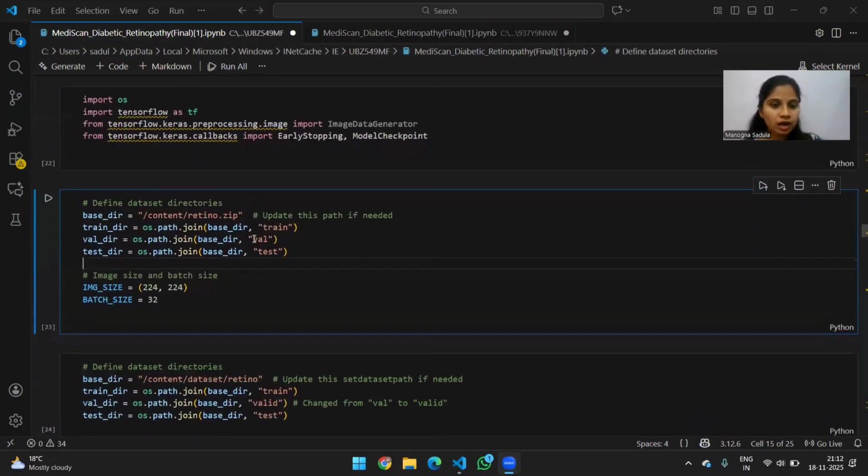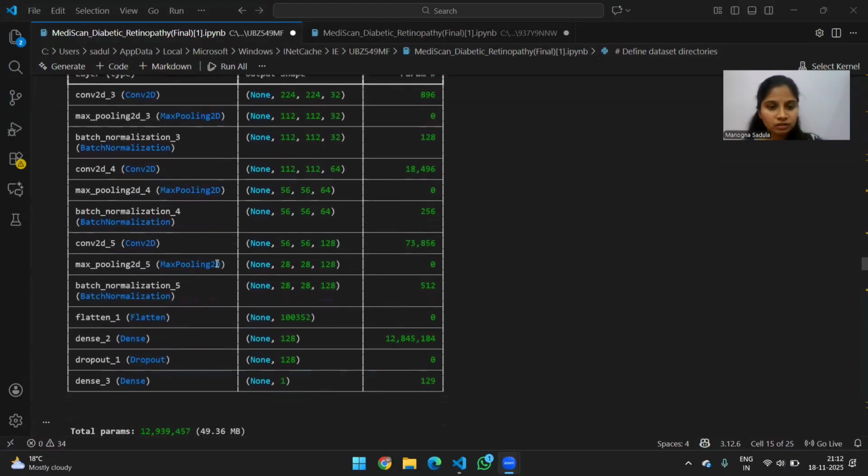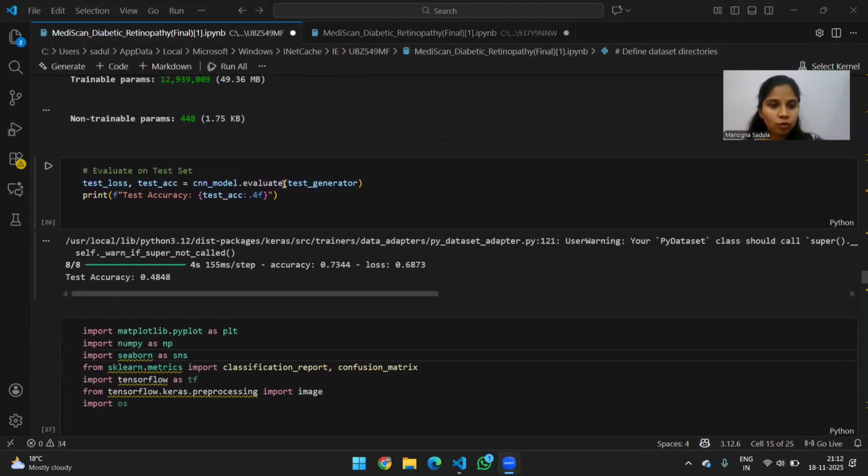If we come down here, we have this block of code where we set the dataset path for validation, training, as well as testing. So this describes the model, where to find the data, and how to process it. Then coming down here, we have this block of code where the model is evaluated on the test dataset, and we get the final accuracy as 0.4848.